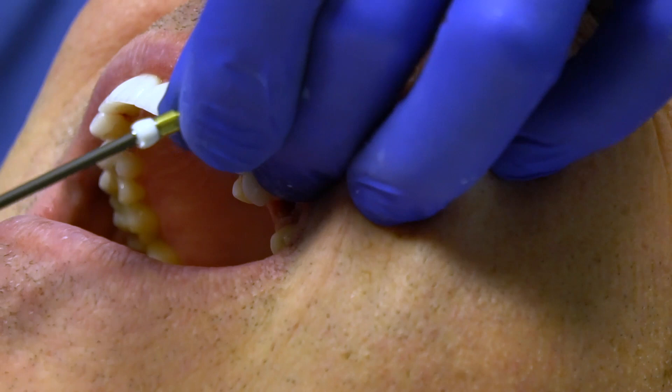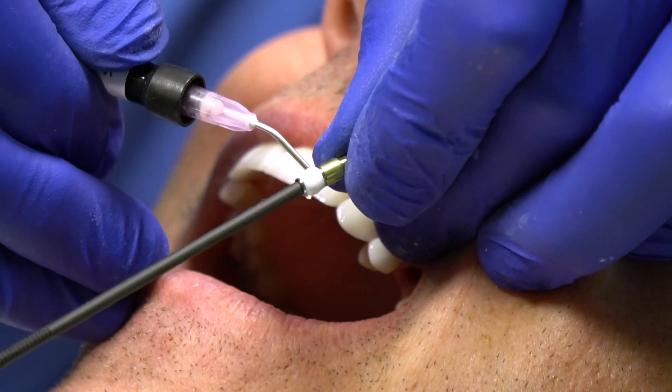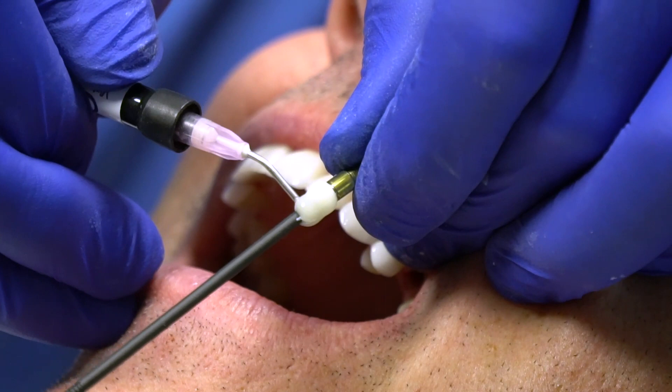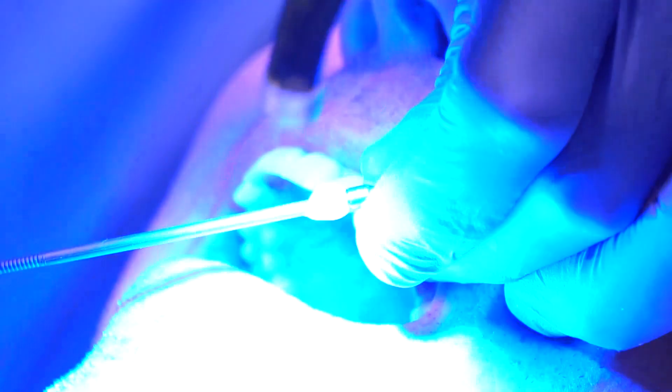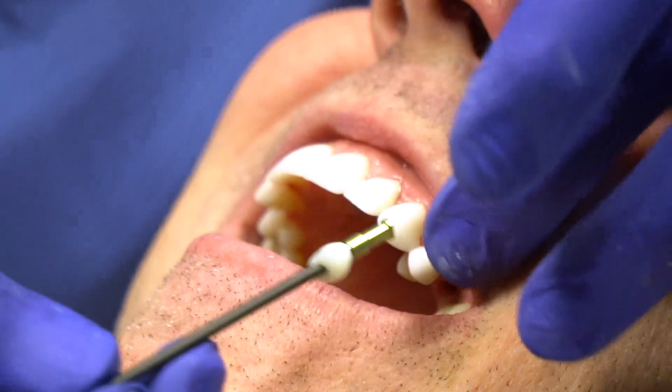Now I pick my tooth color. There are two types of tips — the pink tip or the black tip; in my office I use a larger tip. I'm going to roll out and build up a chimney, going up on this composite, creating a chimney around the microbrush. Light cure that. Now I have a blob. If I was going to do this on the anterior, I'd be building the chimney up higher. For a bicuspid, I don't need much more height than I already have.